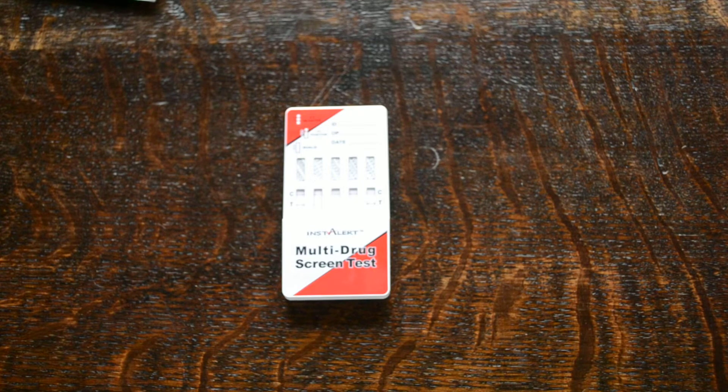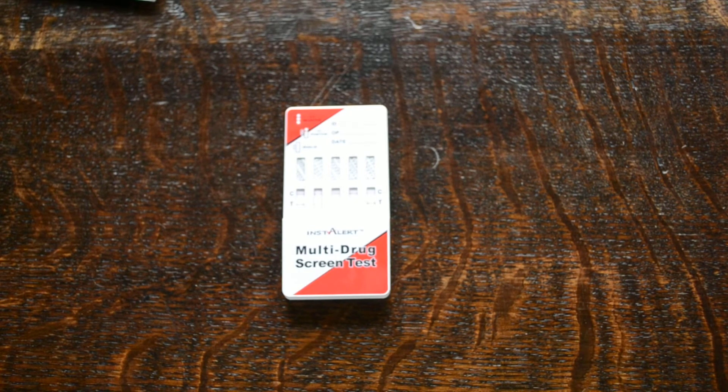That's a demo showing the Instalert seven panel drug test, including methadone, barbiturates and benzodiazepines.